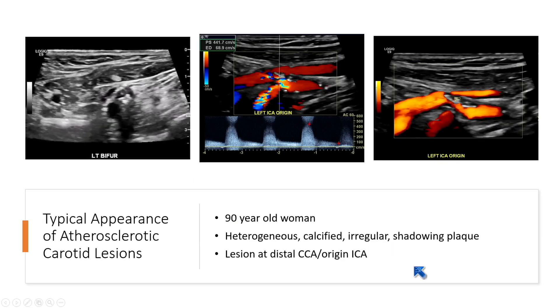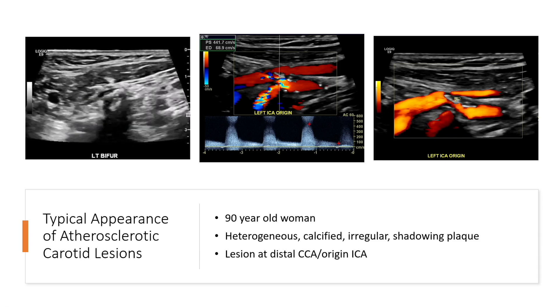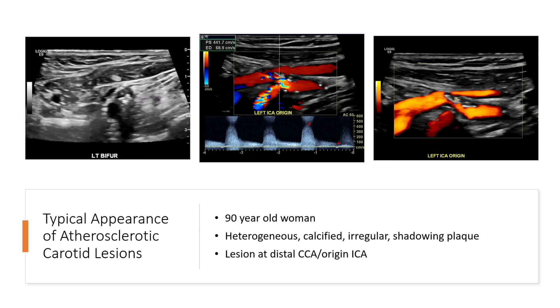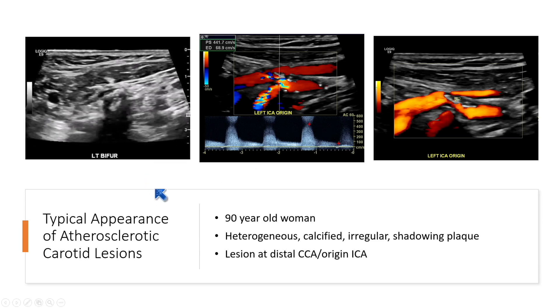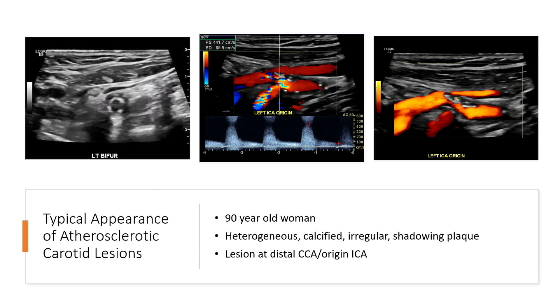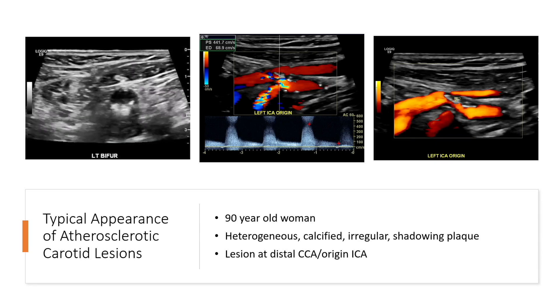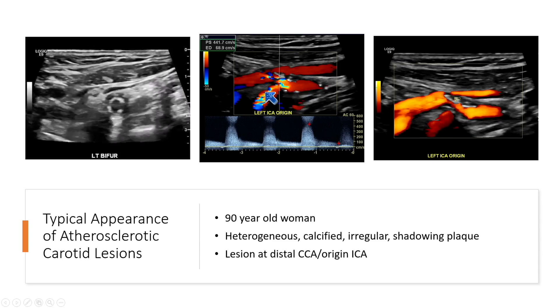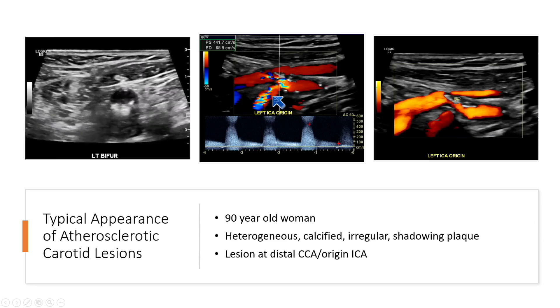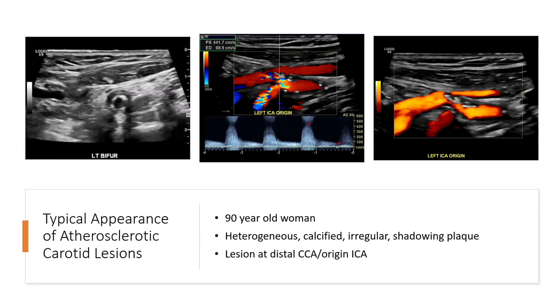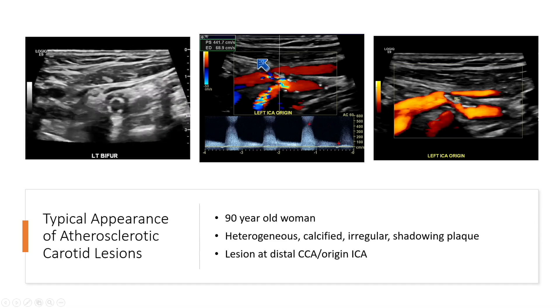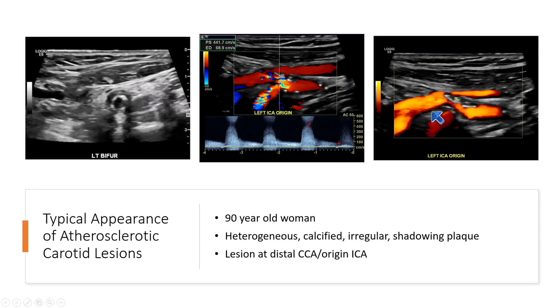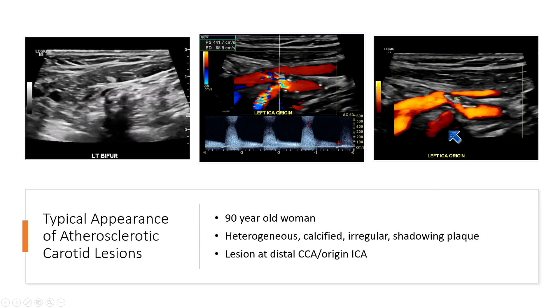This is the typical appearance of atherosclerotic plaque and atherosclerotic carotid disease. These are images taken from a 90-year-old woman. We can see on this grayscale image that there is heterogeneous, calcified, irregular, shadowing plaque. Lesions tend to be at the distal CCA and the origin of the ICA — bifurcation lesions, as noted. We see marked velocity elevation at the area of plaque and evidence of narrowing at the distal CCA and proximal ICA.